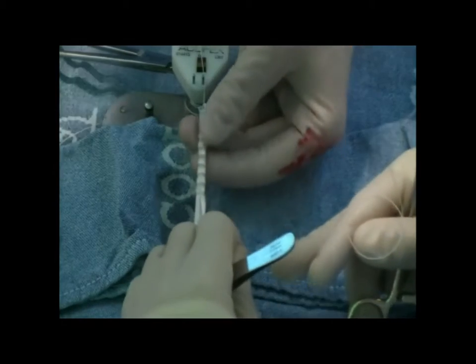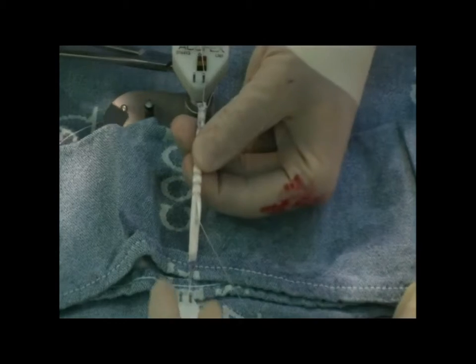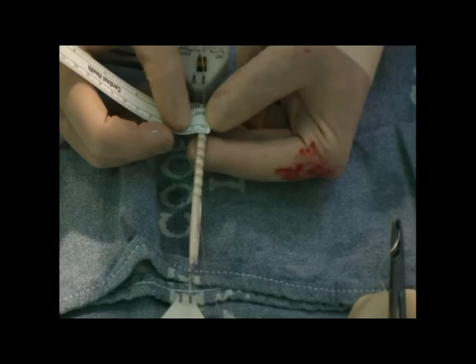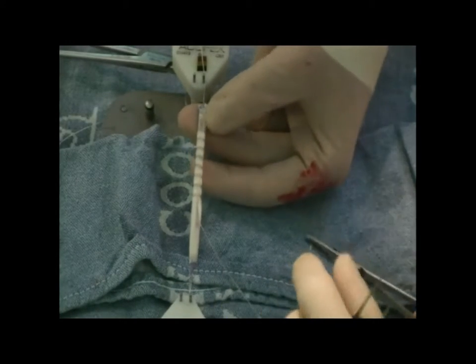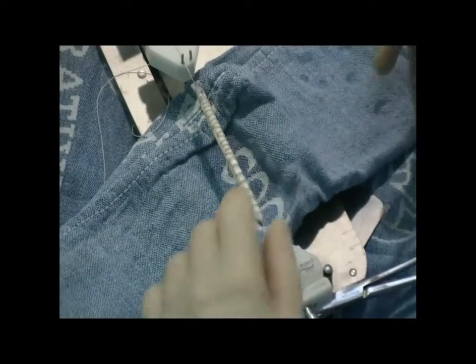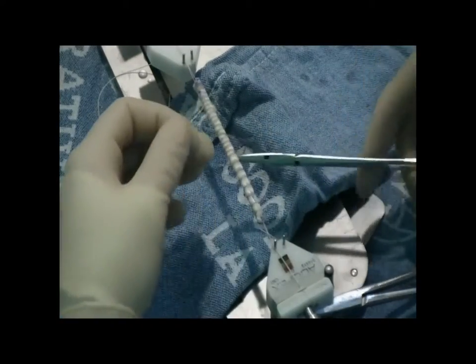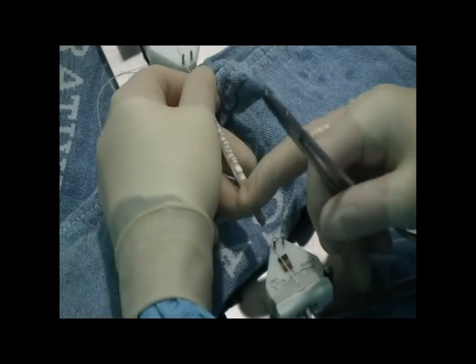You can see my hand has come into the field now and I'm assessing that everything is uniform and that the size is right. I'm looking for a final graft diameter of about five to six millimeters depending on the particular acetabular rim that I'm working on. Five and a half millimeters seems to be the perfect size in most situations. Again, too large a graft will always give you a seal, it's just hard to get it compressed. Too small a graft is easy to get adequately compressed for incorporation, but more challenging to obtain a seal, so your anchor position in these situations is even more important.